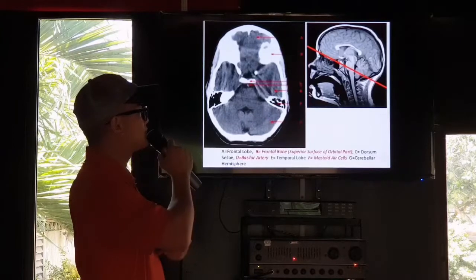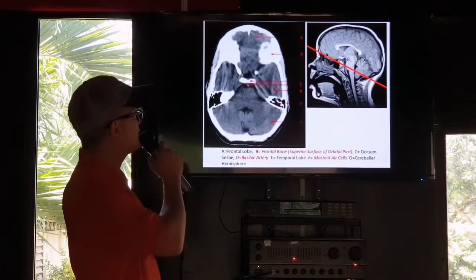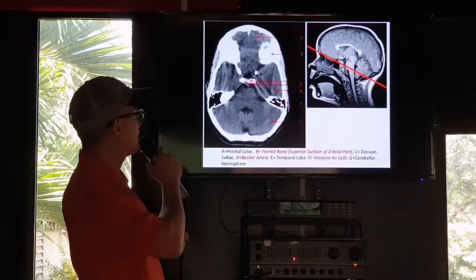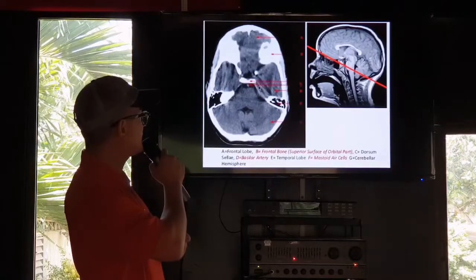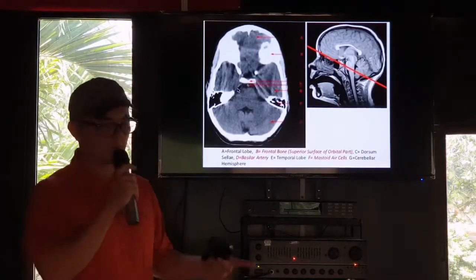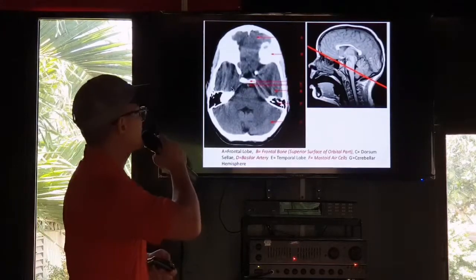So this one, just above the foramen magnum, about the level of the base of the frontal lobe, above the anterior cranial fossa, you have the frontal lobe, of course, the dorsum sellae, where the pituitary gland is found. You have the basilar artery right here. This is a blood vessel. Remember, the basilar artery is formed from the 2 vertebral arteries around the lower surface of the pons. They join together to become the basilar artery.